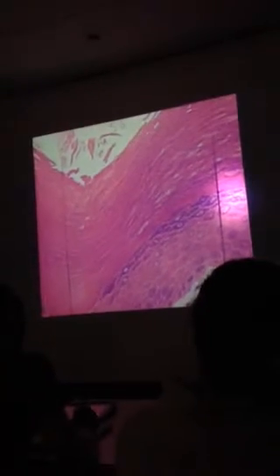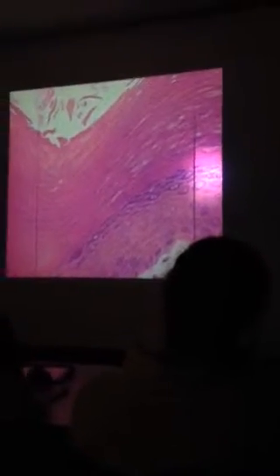But I would ask you this. See right here? See these cells that are purple? What other things have you seen that you see cells that look like this in the middle? This is clearly the granulosum. That's your pivot point. This is your spinosum, and this is your basale. Again, not everything looks identical to pictures you look at in the book. This is why you have to use your judgment.